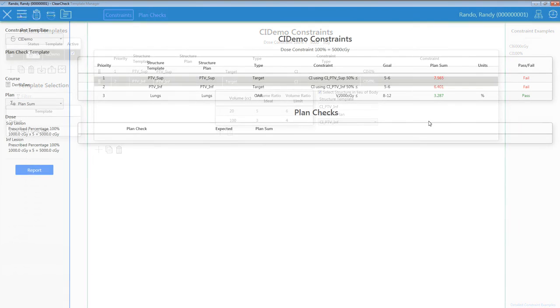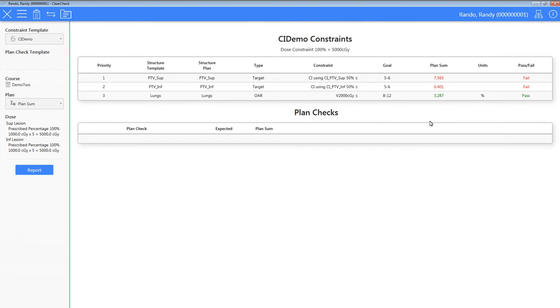That's it. I can now easily run two CI constraints on different targets in the same plan sum and evaluate total lung dose in the plan sum.